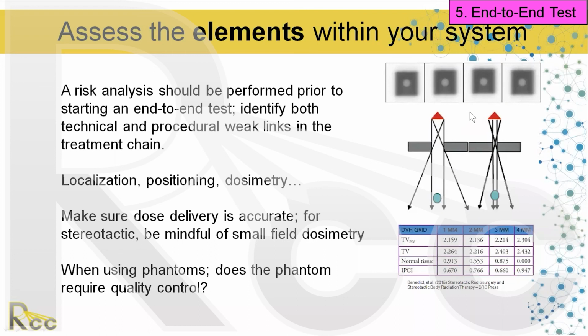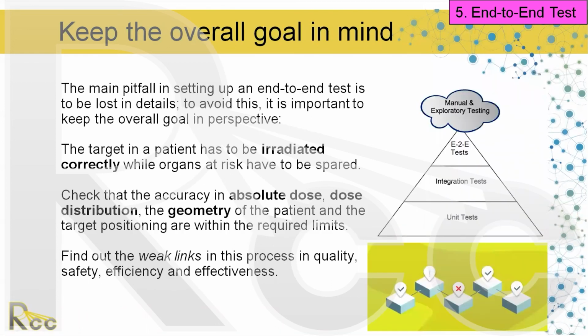And then, one thing, this table right here, is also being mindful of your dose calculation grid. That's really critical. People have learned that the hard way. If you're going to be treating really small lesions, you should really have a small dose calc grid. If you're using a 3 millimeter calc grid or 2 millimeter calc grid, you're not going to get as accurate a representation of the dose distribution. So being mindful of those elements and taking the time to dial it in and look through it. So, to mention again, the devil is in the details.